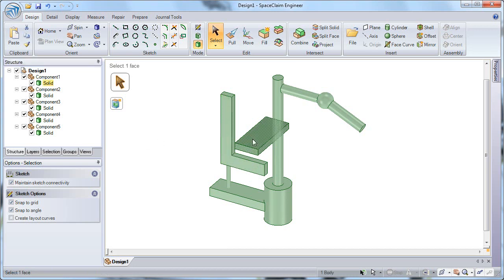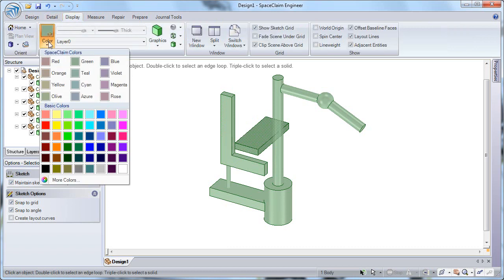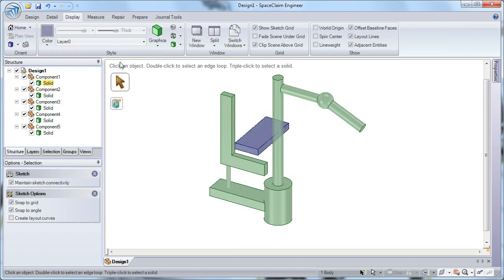So we can also edit the display of these solids if we want to make the difference more drastic. I can triple click on my table, go to Color in the Display tab, and change that to a blue color.